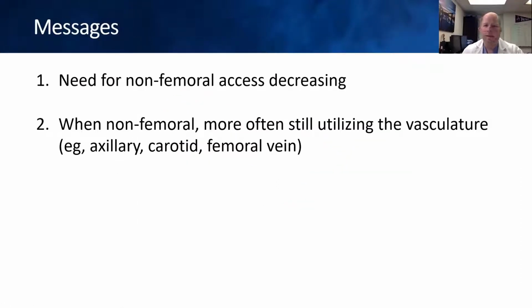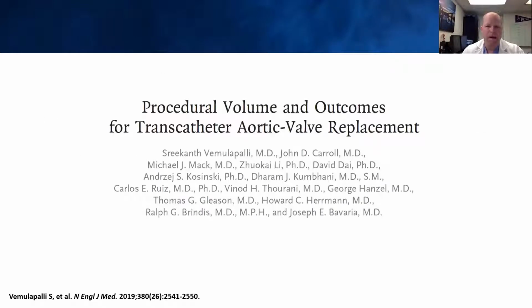So, need for non-femoral access is decreasing, but when non-femoral access is being used for TAVR, it's still more often utilizing the vasculature.